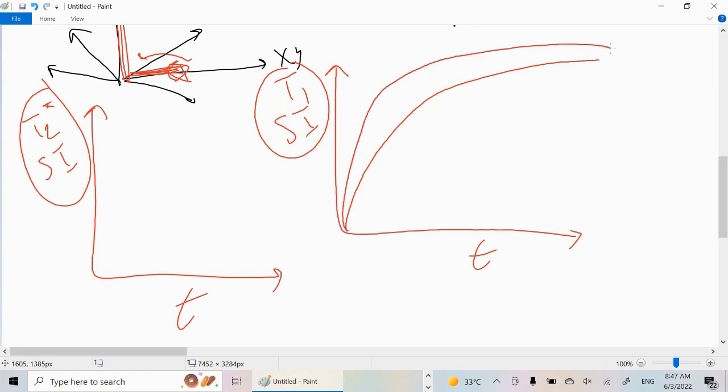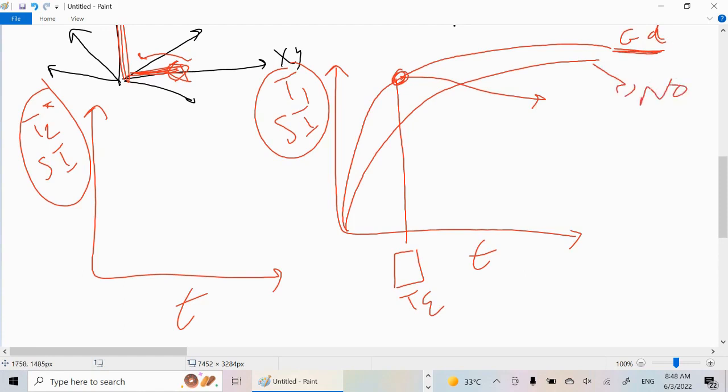This means that at a certain point in time, if you record, you will find that the signal I receive from the tissue with gadolinium contrast is higher. The signal that comes from the tissue without contrast has a lower intensity. This is what we see in T1 weighted images where we did not use contrast.